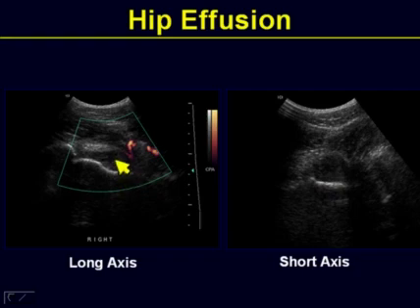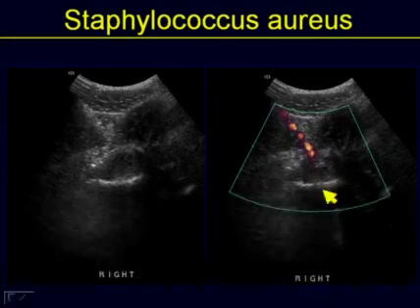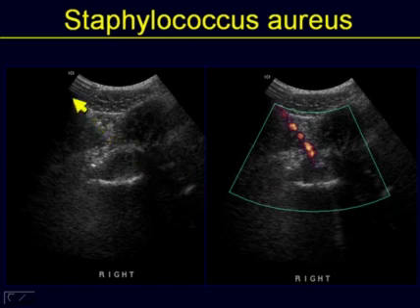And when you do that, as you appreciated on the long axis view, note that on the short axis view, the markedly distended capsule in the subfemoral region, confirmation of the effusive hip at this point. Very simply, therefore, still in the short axis view of the right hip, you can introduce a needle, as shown here by this high-level linear echo.